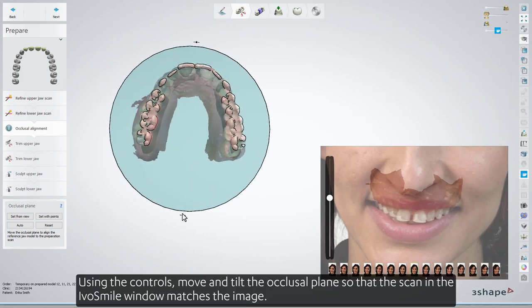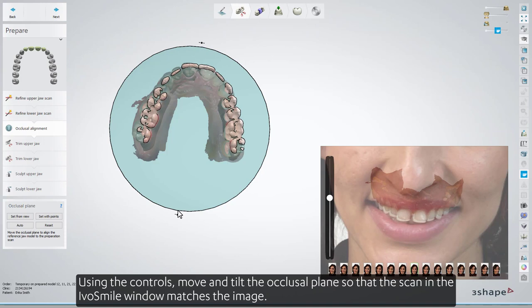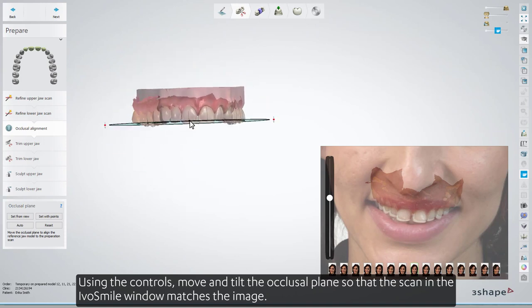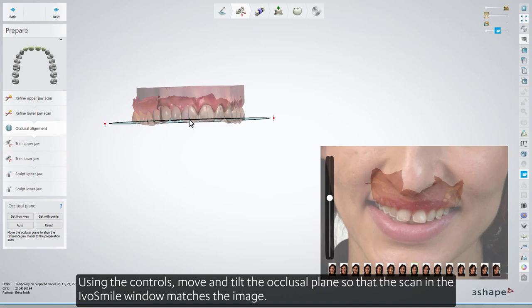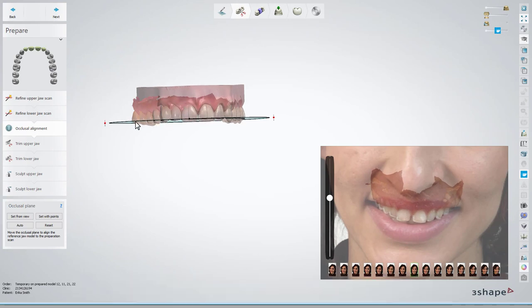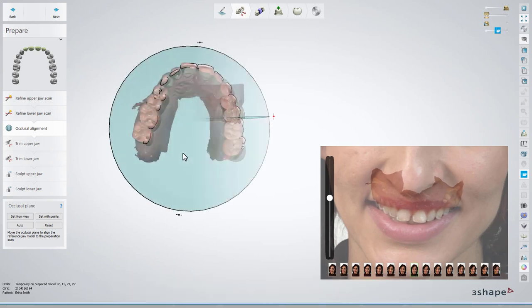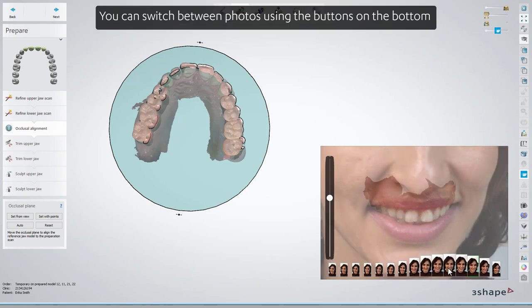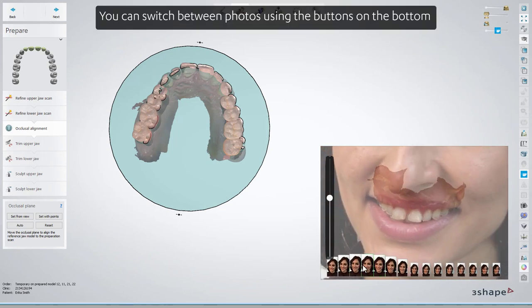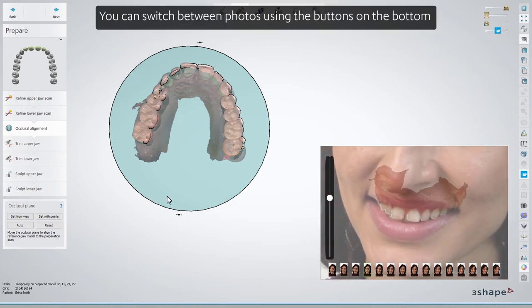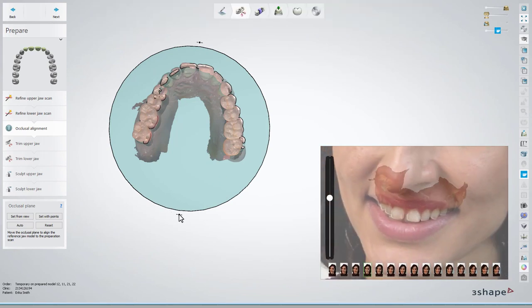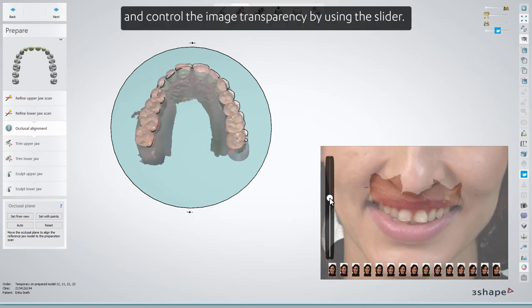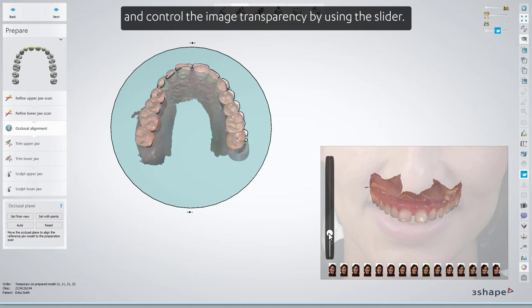Using the controls, move and tilt the occlusal plane so the scan in the IvoSmile window matches the image. You can switch between photos using the buttons on the bottom and control the image transparency by using the slider.